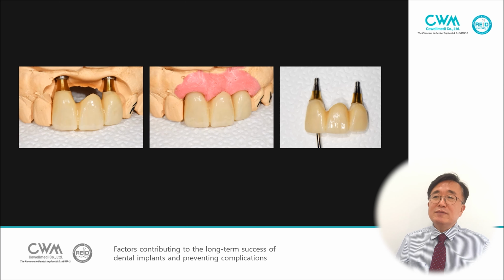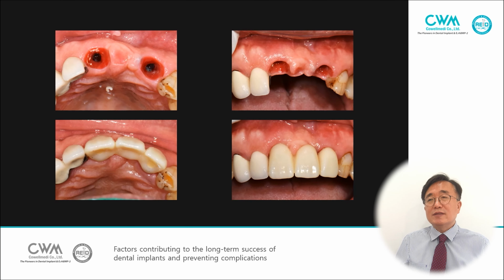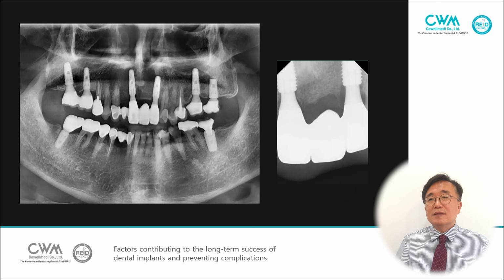And a speed zirconia bridge is connected 3 weeks after surgery. The emergence profile is maintained. And here, the aesthetics and the emergence profile and smile line are fabricated.